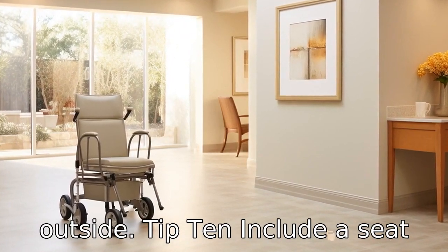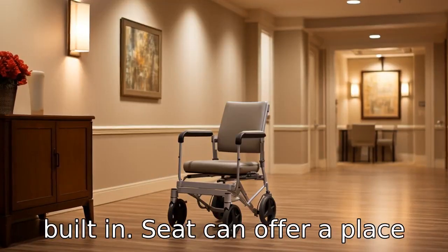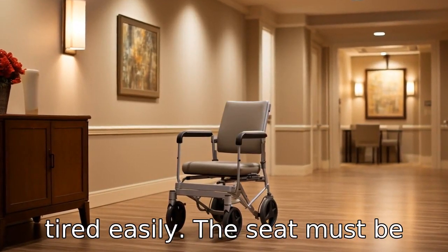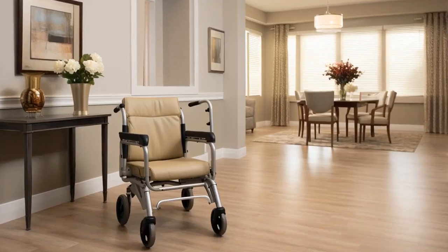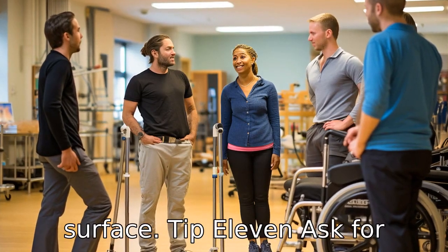Tip 10. Include a seat in the design. A walker with a built-in seat can offer a place to rest for seniors who get tired easily. The seat must be sturdy, comfortable, and preferably with an easy-to-clean surface.